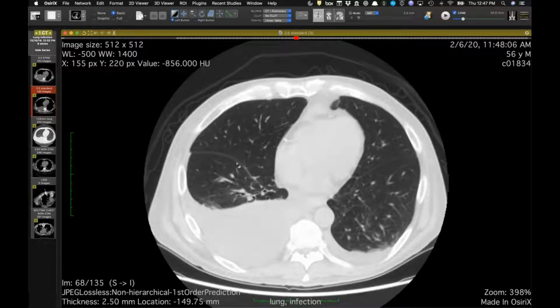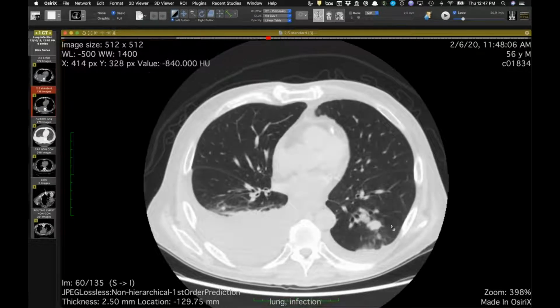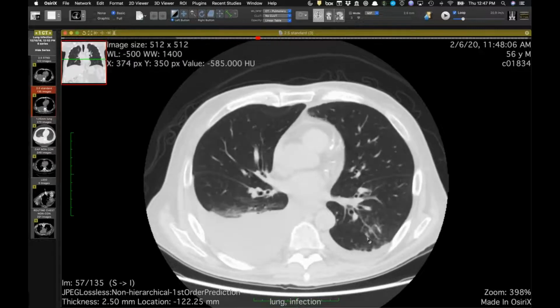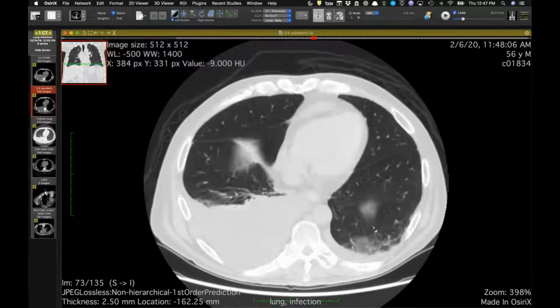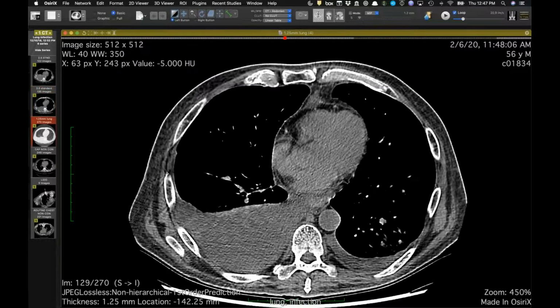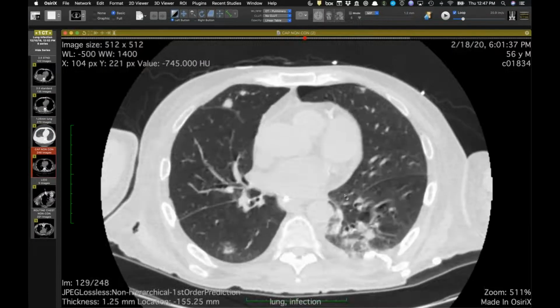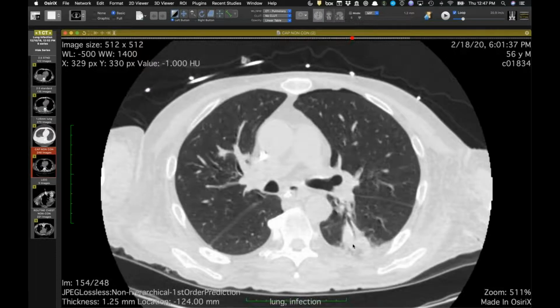Then they go to an outside hospital in February, start to have the dwindles, some fever, night sweats, chills, a little bit of whatever other symptoms. And you can see there's a bunch of nodules. They tend to be clustered more in the left lower lobe. There are a couple here on the right as well. There's also a small left effusion. Then we can move forward a couple weeks. Now by this point, their effusions have gotten bigger and they've placed pigtail catheters. And this area has kind of coalesced in the superior segment of the left lower lobe.